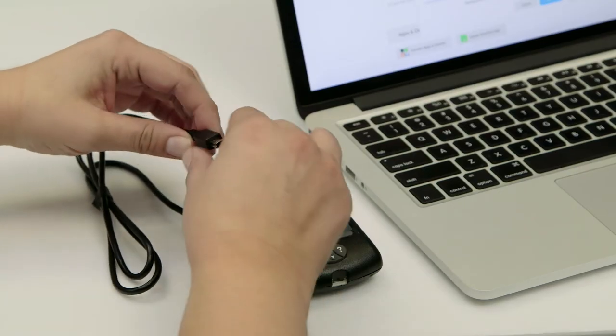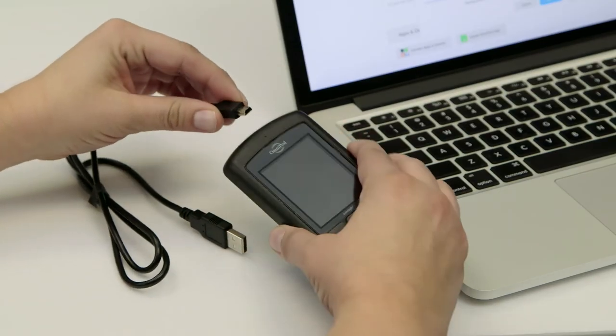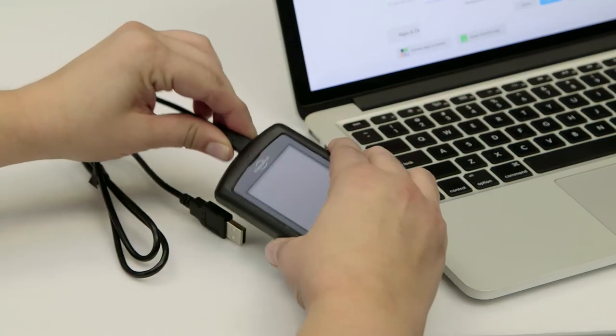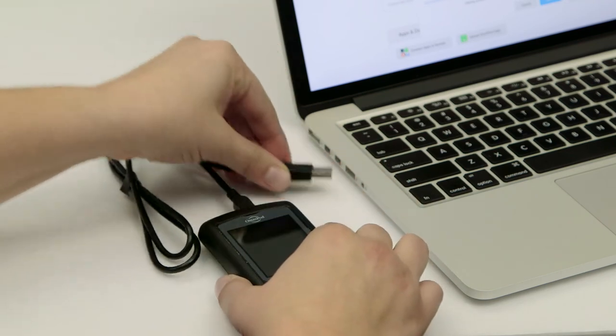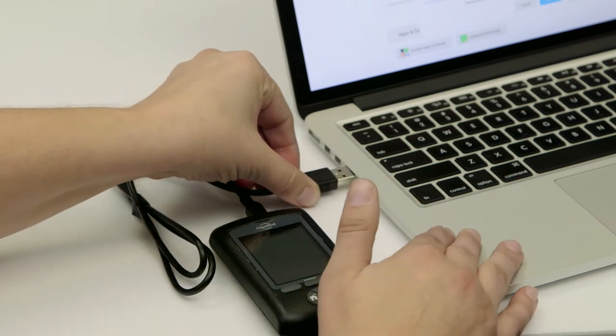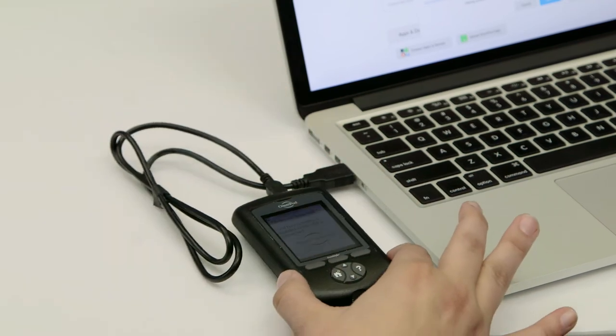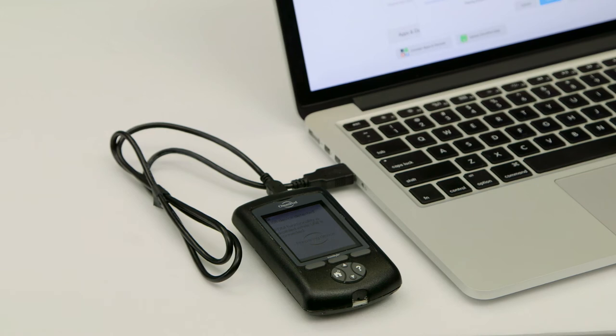Plug the USB-A side of the USB cable into your computer and the mini side of the cable into your Omnipod.